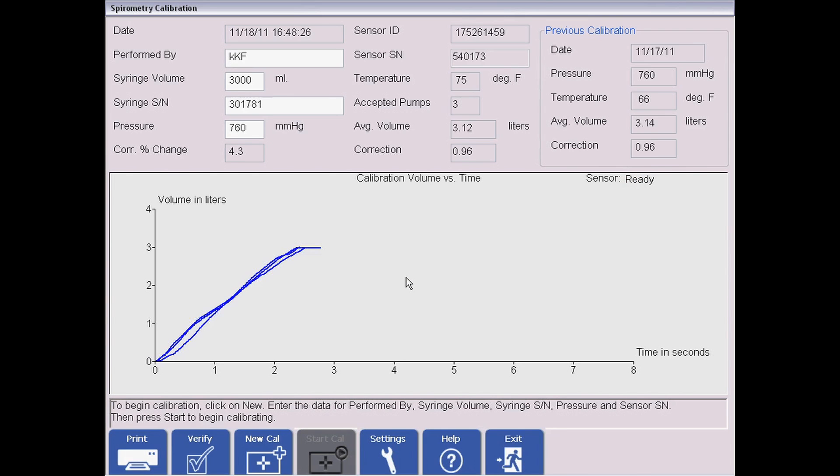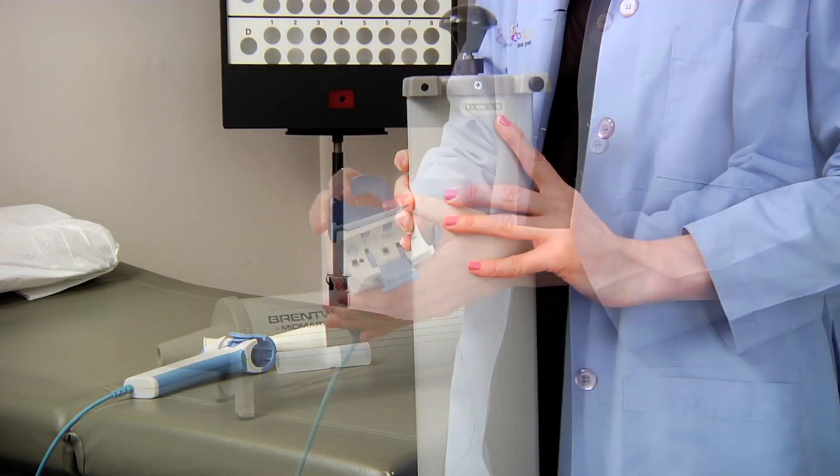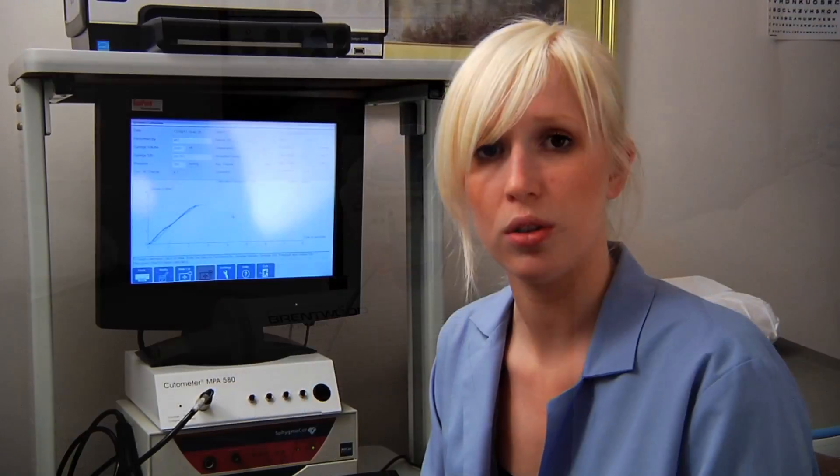The first time you open up your calibration page, you're going to have to enter some information: the serial number on the syringe, the serial number on the spirometer, and a couple other pieces of information. For the first time you do the calibration, just see the Midmark manual. After that, all your data will populate automatically.